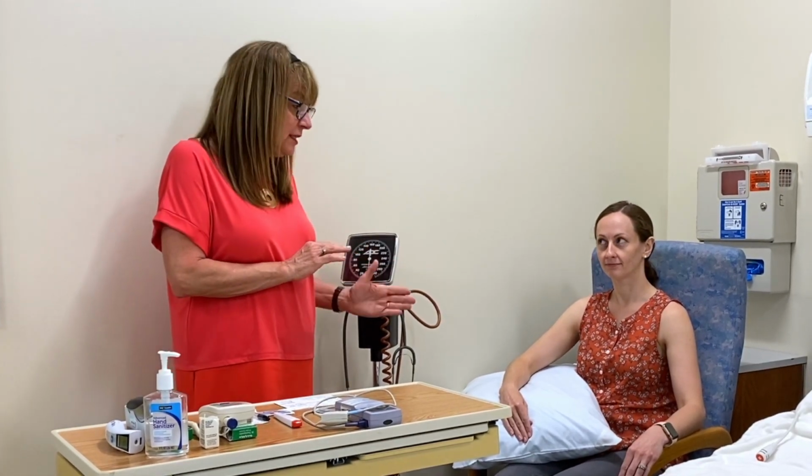Remember, when you're taking a blood pressure, the person should be seated. The person should have rested for a few moments. I don't know if you've ever heard of white coat syndrome, but sometimes we go to the doctor's office and we're stressed out and the first blood pressure they get is pretty high. So the patient should rest for a few moments before you take the blood pressure.